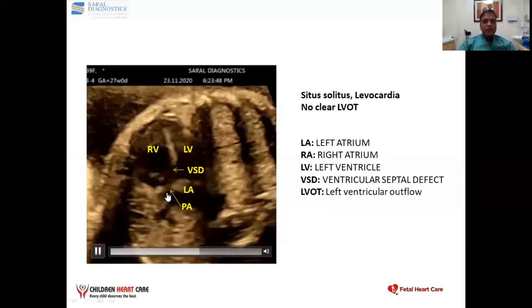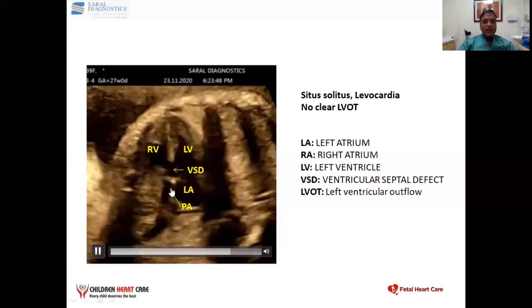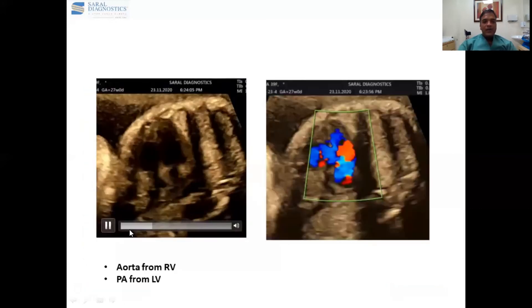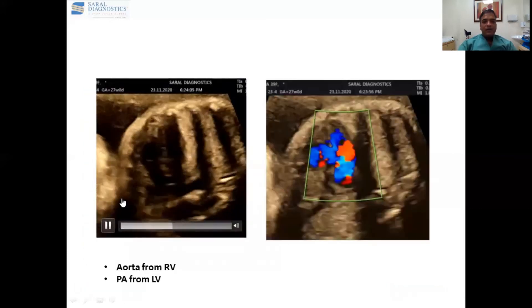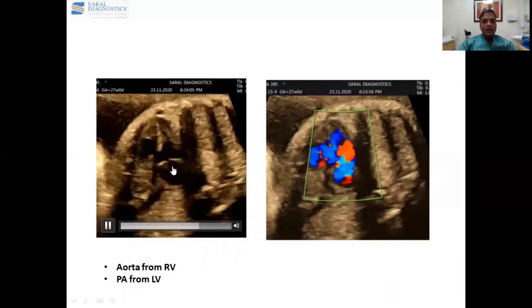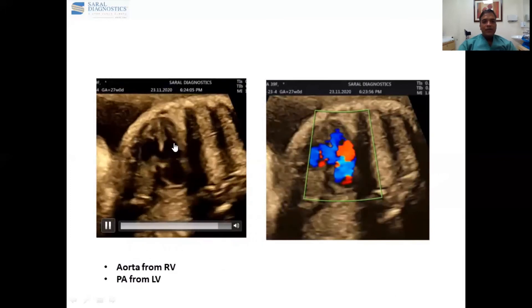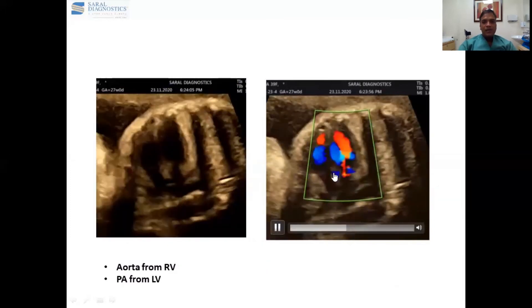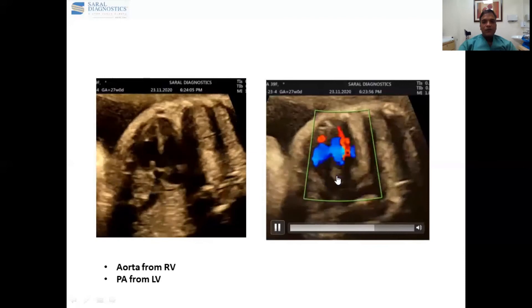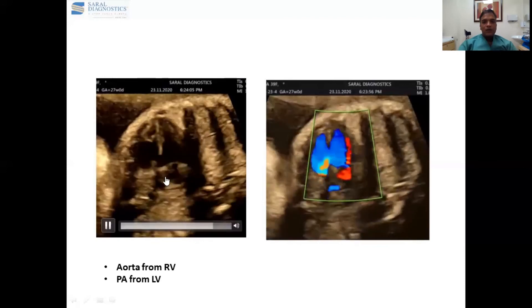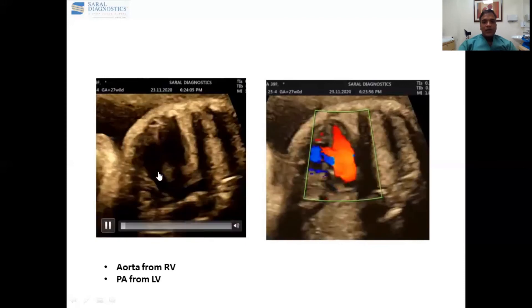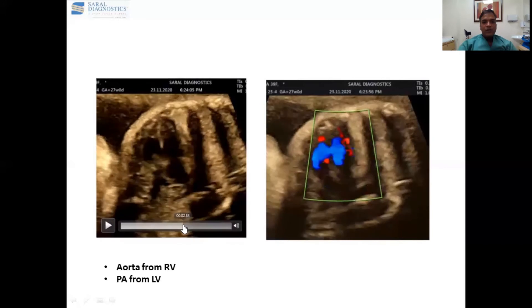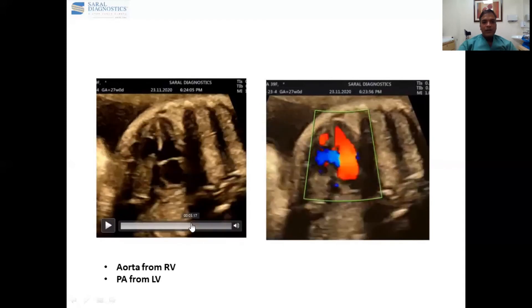It is the pulmonary artery here. In the same patient, in a different plane — left atrium, left ventricle, this is the VSD. As you can see in the simultaneous color flow, this is the pulmonary artery — a very clear demonstration of the pulmonary artery.